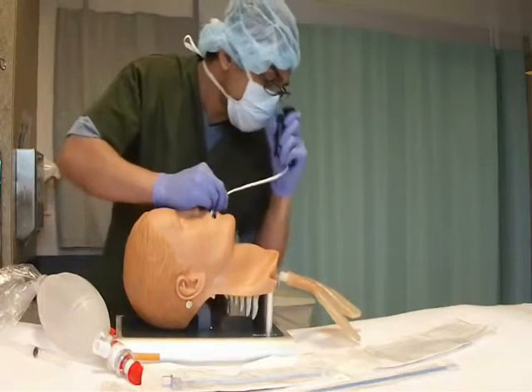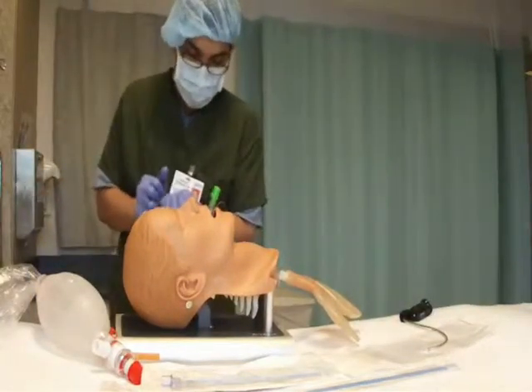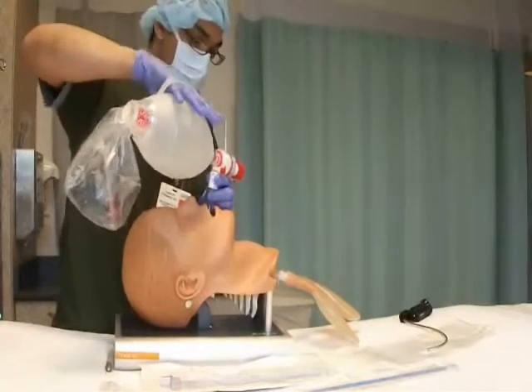Once the ET tube has been placed, confirmation of correct placement is done using regular methods, for example capnography and seeing the chest rise with ventilation.